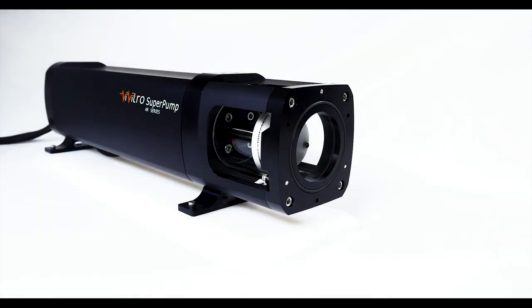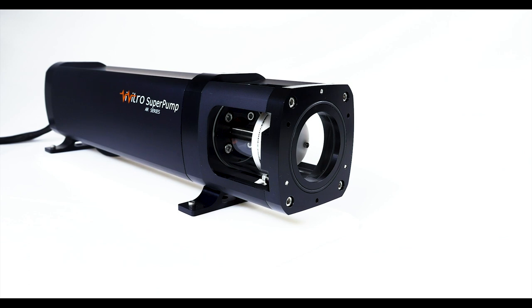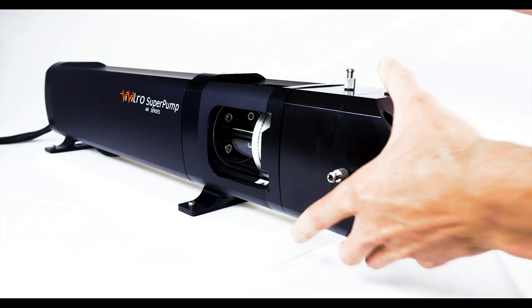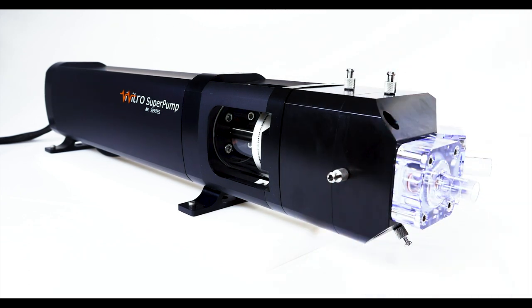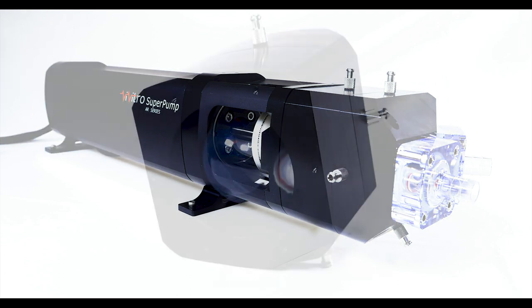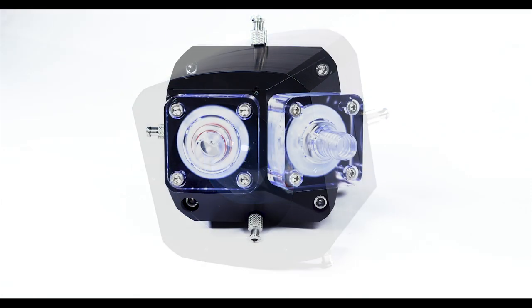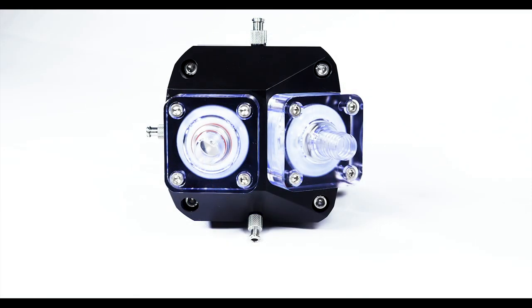An optional pump head can be used with the super pump to convert the piston motion to circulatory pulsatile flow using an inlet valve and outlet valve. The pump head is composed of a silicone ventricle with an inlet and outlet valve to simulate one half of the heart.